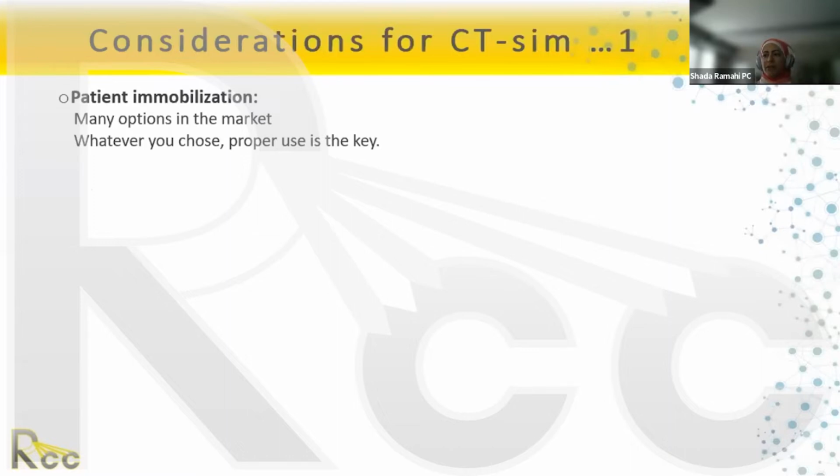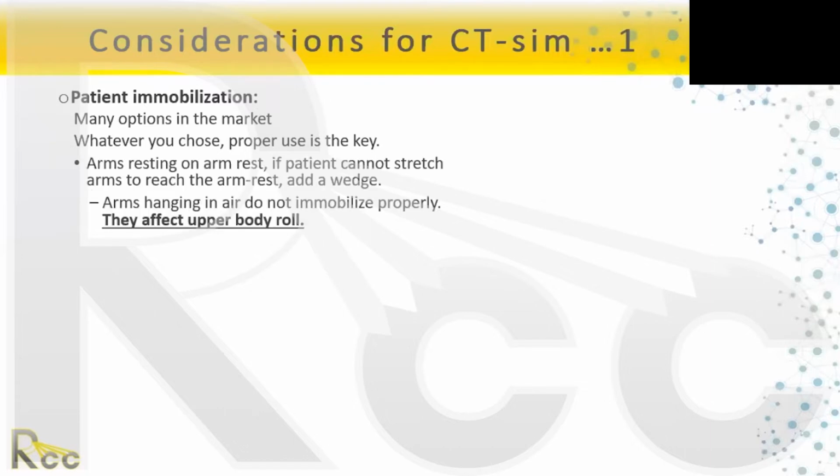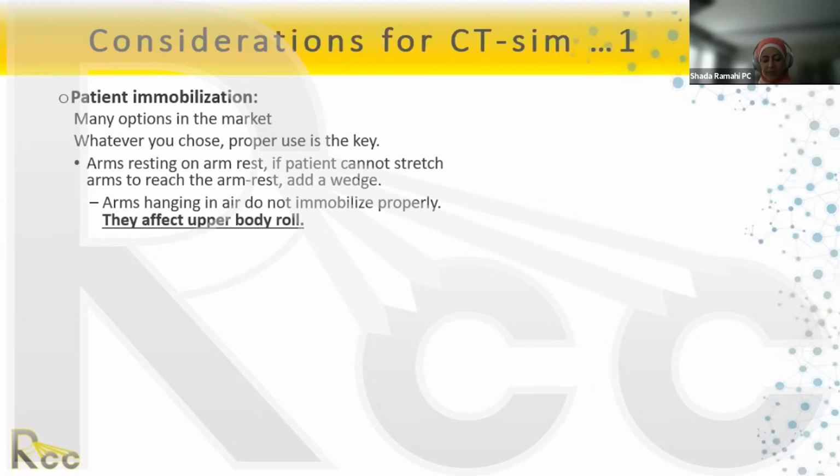So, patient immobilization: there are so many options on the market. Again, we're not going to push one vendor over the other. There are a lot of good options out there, and whatever you choose, the key is to use them properly. I'm going to present the most common, not mistakes, but the most common reasons that lead to misalignment.